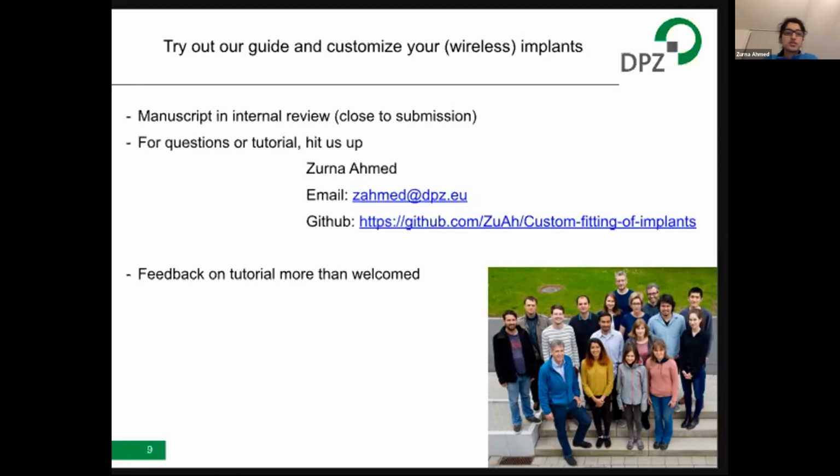Yeah, sure. So for sure, if you would get, let's say, a commercially available bent standardized implant, which doesn't exist like this, but even if you take a flat one and you match it to one type of skull surface, it will, in 99% of the cases, I would say, not fit exactly to the other one. So the skull surfaces are actually quite different. And you really want to get as close a fit as you can, because otherwise we have a lot of problems with tissue ingrowth and also infection getting inside and then basically rejecting this implant.